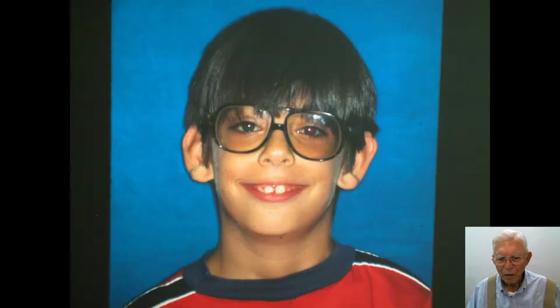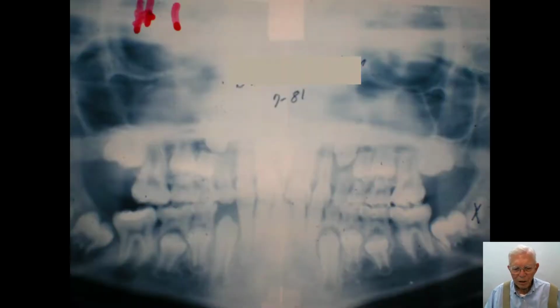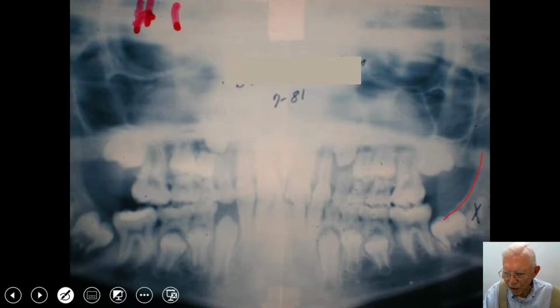But let's take a look at this young man. This is a nice little kid. He's got some real problems here, and this is just his facial structure. Now, the guy comes in, and I assume that he came to me, and so I probably made this mistake myself. Now, at this point, the jaw structure is coming up in here, and this is the second molar, and here's a wisdom tooth, and it would be very unlikely he'd ever get a jaw long enough to put the wisdom tooth in there, so we're planning at this point to get rid of the wisdom tooth, and you see it marked out over here.